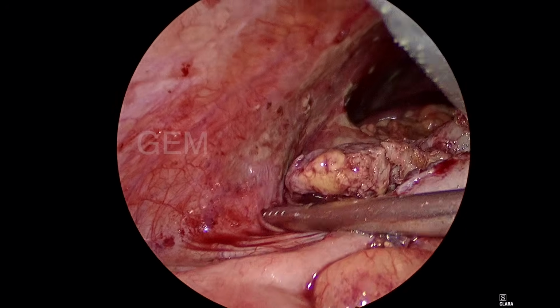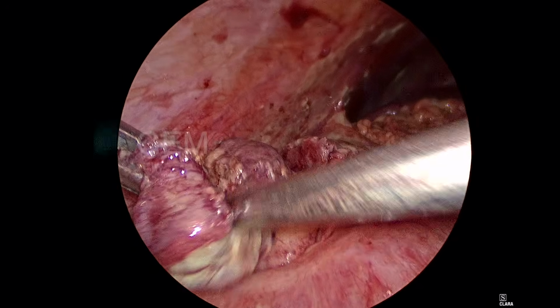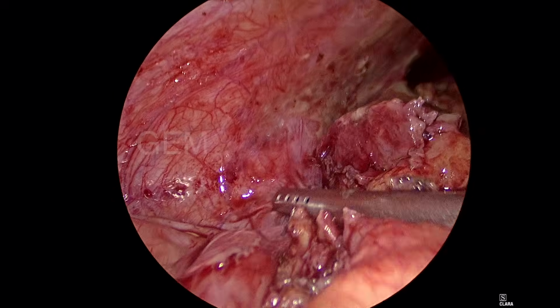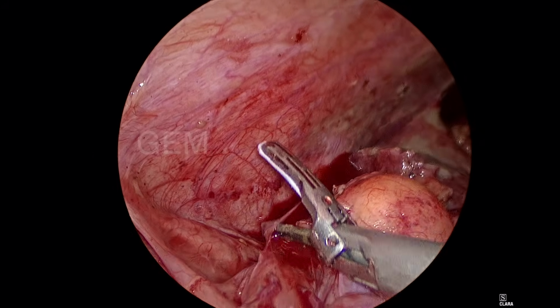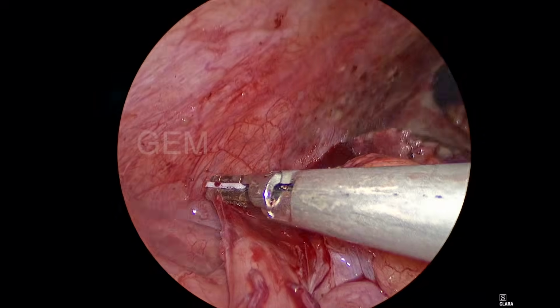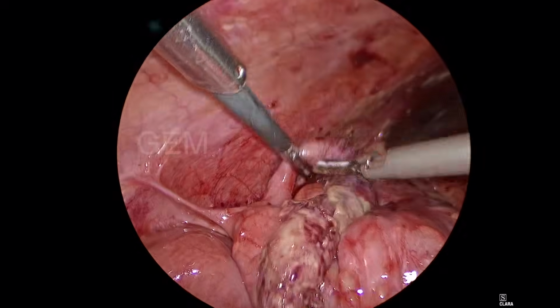So give a wash and then decide. Sometimes washing gives you a clear anatomy. In any surgery, in between give a saline wash and clear the area, and you will understand the anatomy better. Even in acute gallbladder, don't do continuous surgery, give a wash, retract nicely, then see the anatomy and proceed. Same as I am doing here. Otherwise, sometimes the cecal wall gets injured.